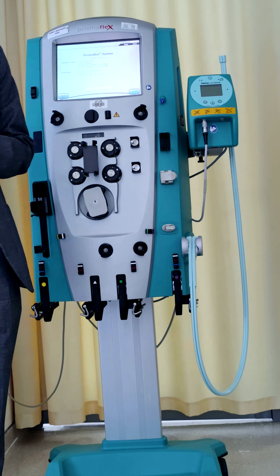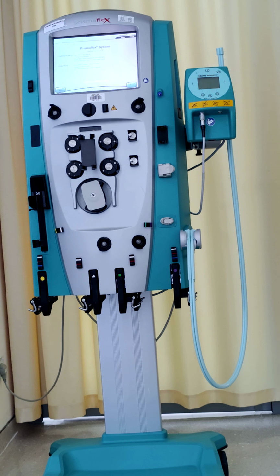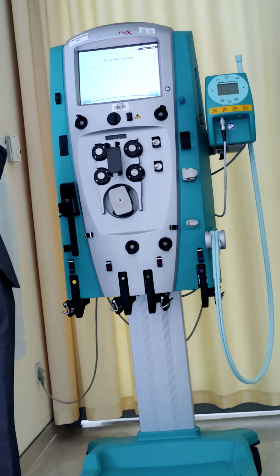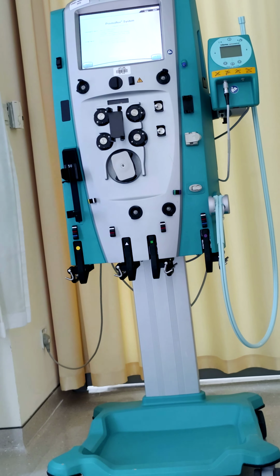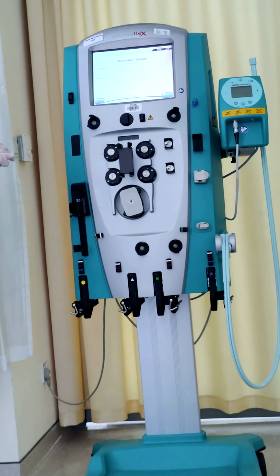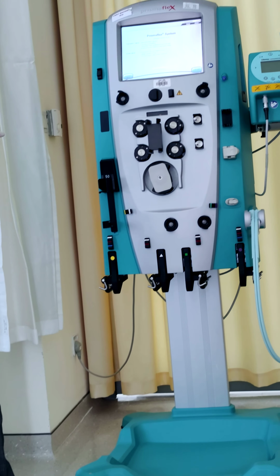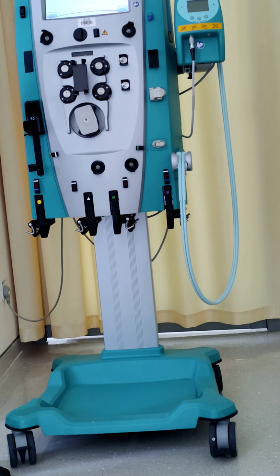He told me that day when I asked what he is planning: albumin. Last time, we did a patient with albumin only. Now you are doing plasma. In the dialysis department we did it before with our machine. We are using plasma plus albumin, so it will not clot and will help to run smoothly. Although once it clotted, we really felt the difficulty, and the patient also felt it.